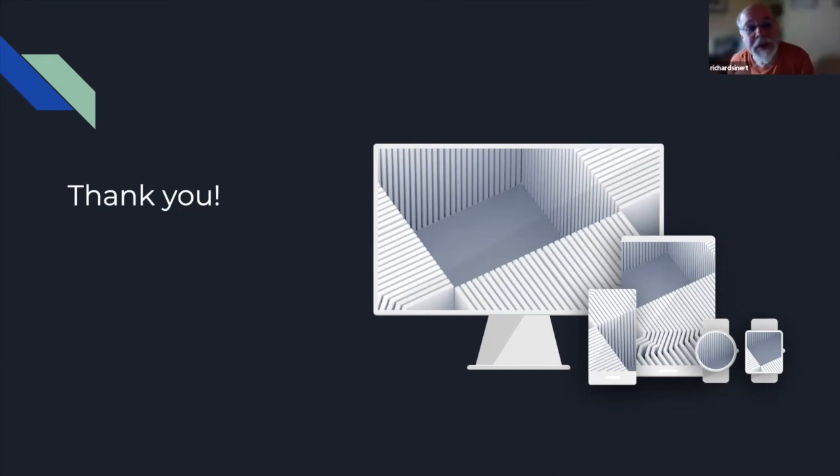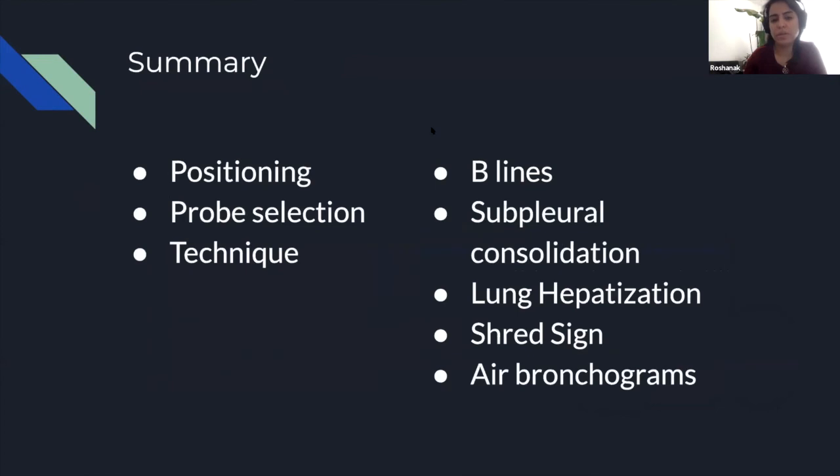The other issue with most of the ultrasound research that's published is they never do inter-rater reliability. I think this is very important to see if the operator and reader can reproducibly identify the same thing on the same ultrasound repeatedly. I think this is a big problem with the ultrasound literature. Zach, do you happen to know if the studies you cited talked about inter-rater reliability, like if two providers do the same scan, did they get the same results? Not really per se, no.